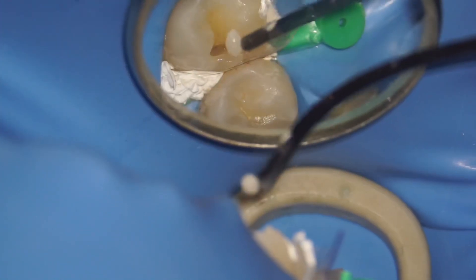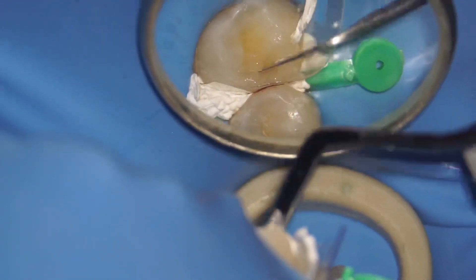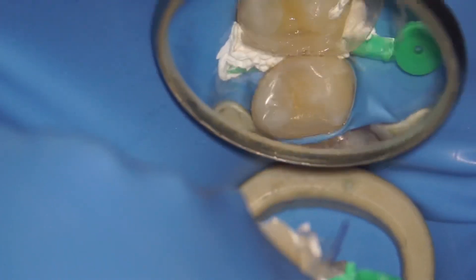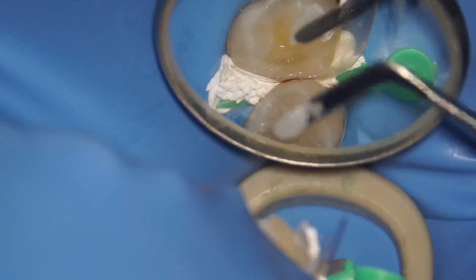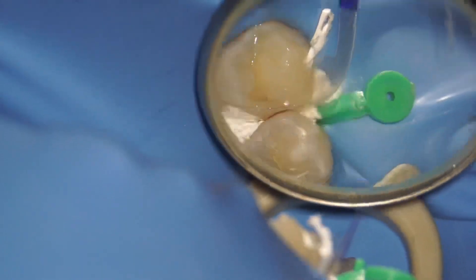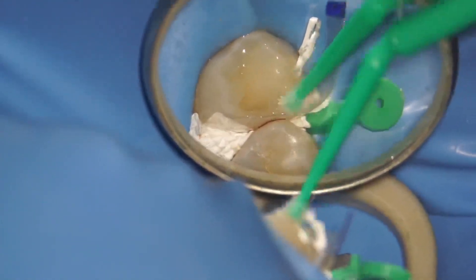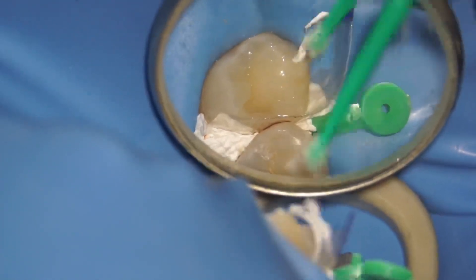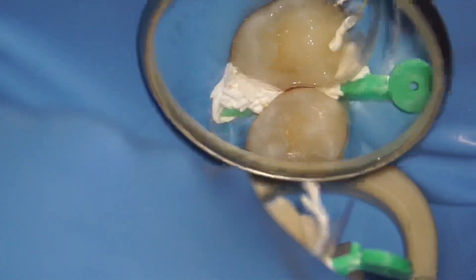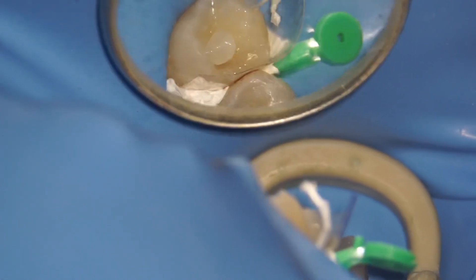At this point, you can choose to remove your matrix or continue building your whole tip — I decided to continue building. I'm placing a dentinal shade here, which is OA2 from Tokuyama Pulvic LX5. Most of my enamel shade was A1, also from Tokuyama. I'm adapting it using a brush with stick resin and a micro brush to build my buccal cusp. Take your time adapting composite as it's easier to adapt un-cured composite than to trim cured composite.